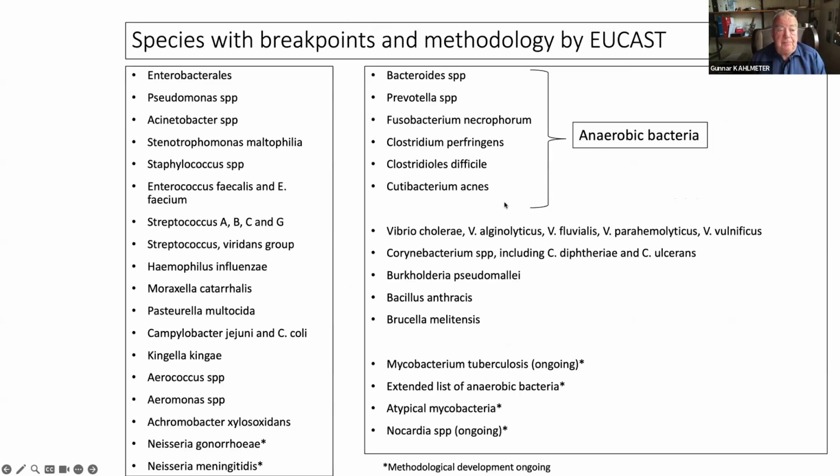These are the species: all the Enterobacteriales, the Pseudomonas species, including other Pseudomonas than Pseudomonas aeruginosa. And we have looked at 6-7 other species to make sure that breakpoints work also for these. Acinetobacter baumannii, Stenotrophomonas, etc., down to Campylobacter and Kingella and Aerococcus and Aeromonas, Neisseria gonorrhoeae and meningitidis, and we're now dealing with all the anaerobes.